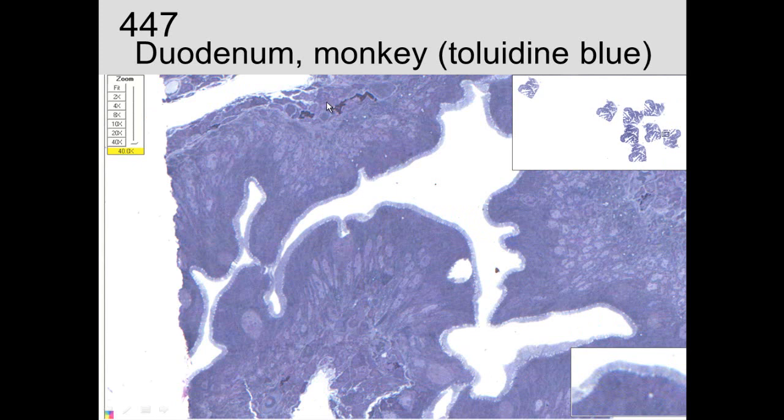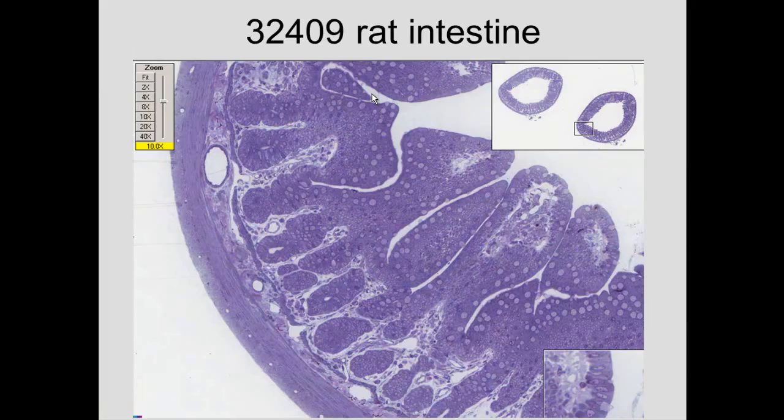Now in the connective tissue here, we can see the central lacteal, which is what we saw before, which is the lymphatic that drains the lipid that you absorb in your gut. And here we see some mast cells. These are mast cells, a certain type of white blood cell.